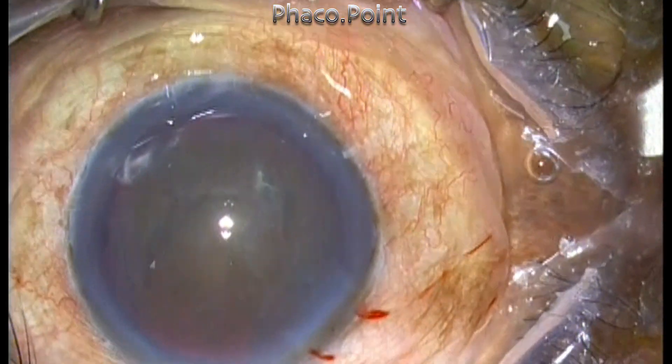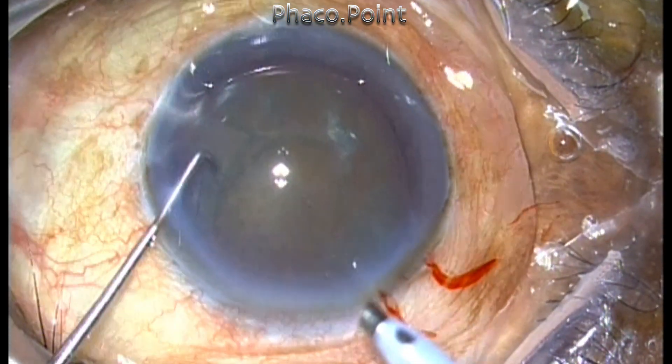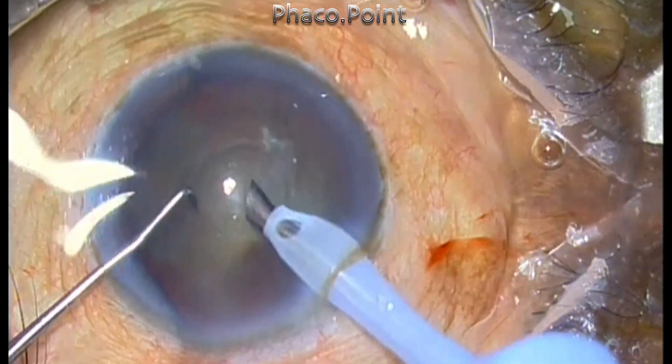Now let's observe how I perform the phacoemulsification. This is being done in a multi-burst mode. I'm using a power of 40% in this patient.